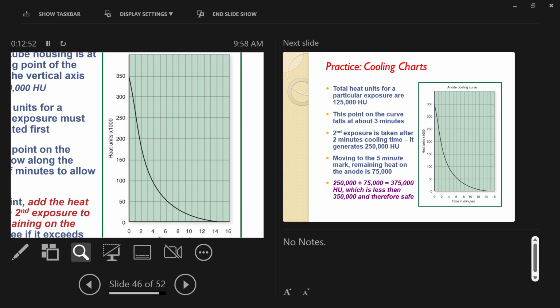Okay. Yeah. So given you have maxed out your machine, it's going to take you 14 minutes with this machine for it to cool down to 0, and now you're cool again. When you're cooled to 0 heat units, you have no heat left over in your machine, it's cold again, okay? It may need to be warmed up. So, if you wait 2 or 3 hours, this happens a lot, right?